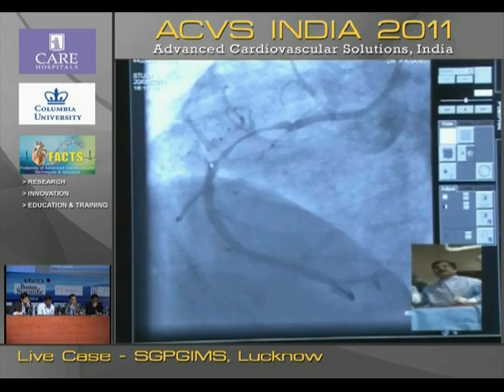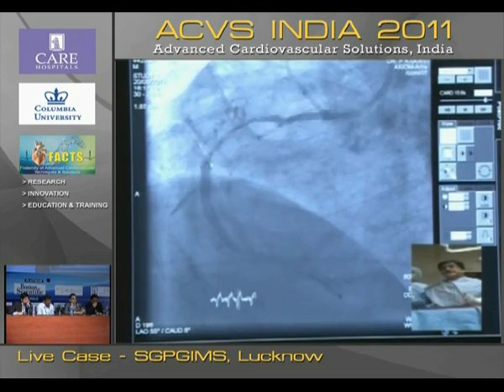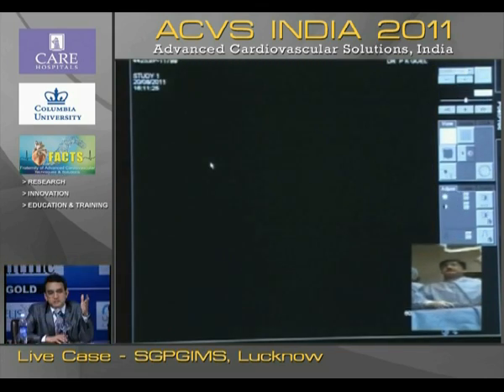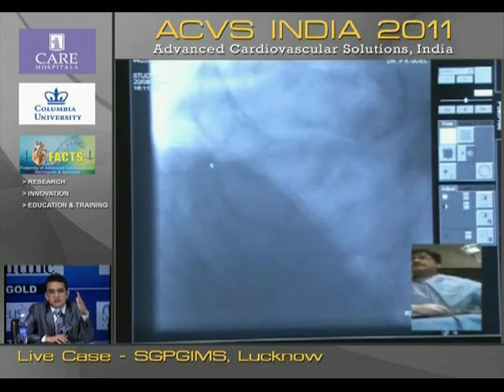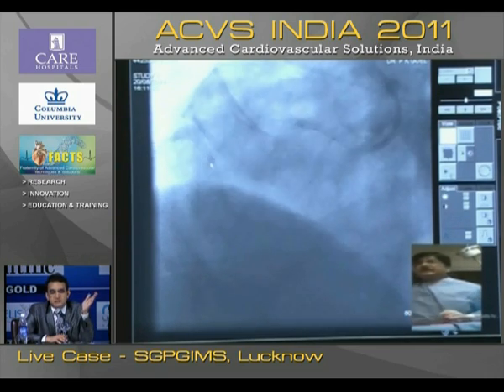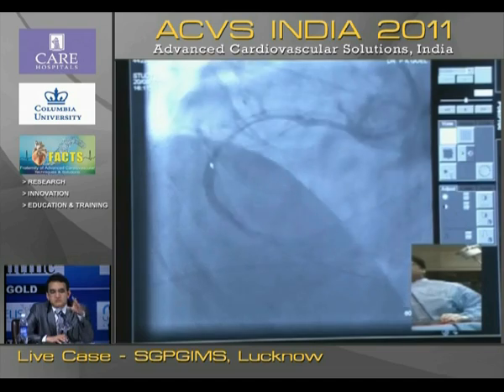And I think the guiding has to... Yeah, your point is well taken. To take the stiff wire to the point of maximum resistance, the other wire helps. It just takes it along by its side. We should not use the stiff wire for crossing, avoiding all those branches and so on.